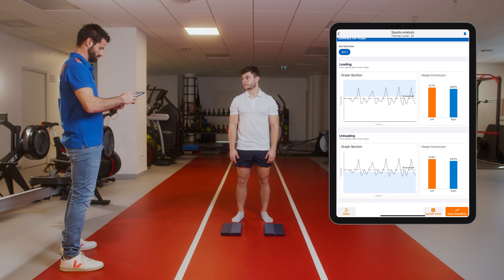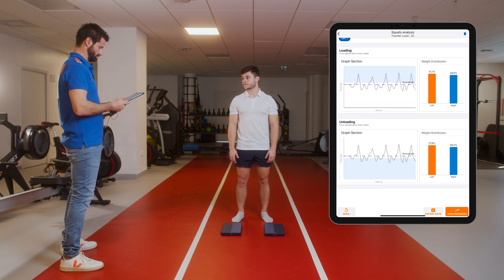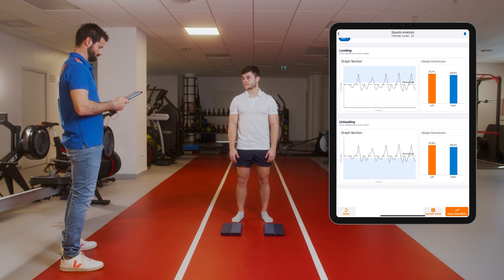This test can also be performed with K-deltas, following the exact same procedure.